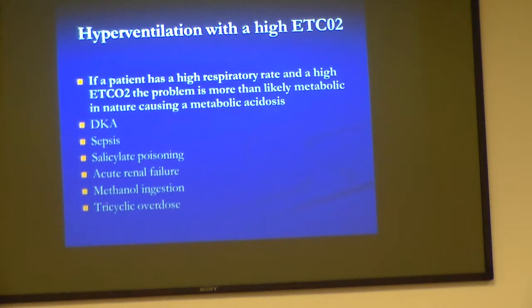One thing that I think is good too, with sidestream and the trending, is that it's a good measure of how sick they are. Yesterday I got to go on a call where we used sidestream, and you could tell the patient was retracting, they were hyperventilating, they had definitely some metabolic issues. I like to use the sidestream and then guess the number.